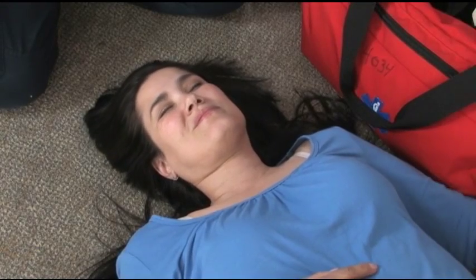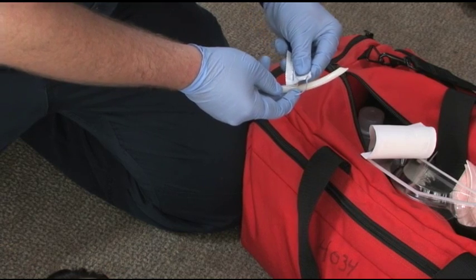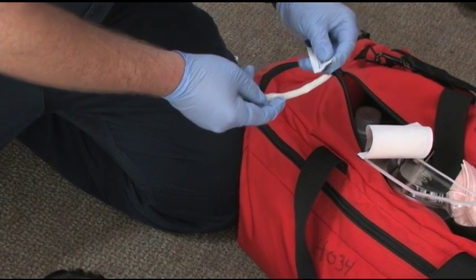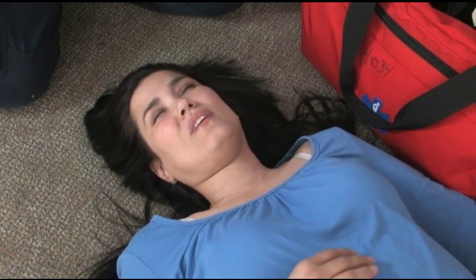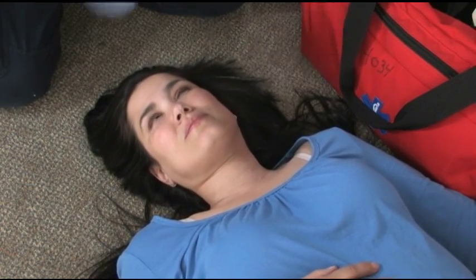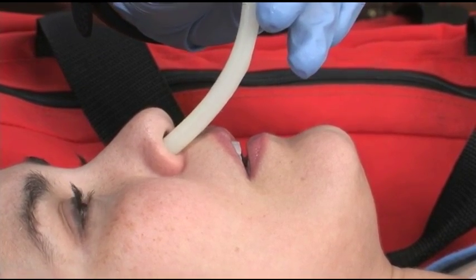Nasal airways should be considered for any patient whose ability to maintain a patent airway is in question, but who still possesses a gag reflex. The patient may have an altered mental status or be unconscious, though typically the gag reflex is lost in an unconscious patient, and an OPA can then be used.